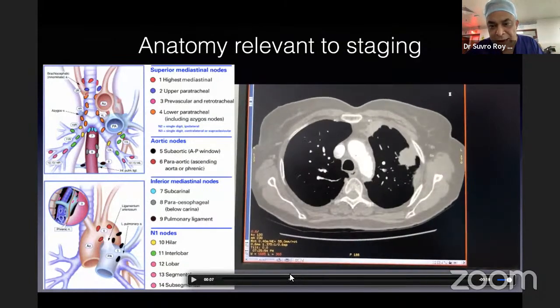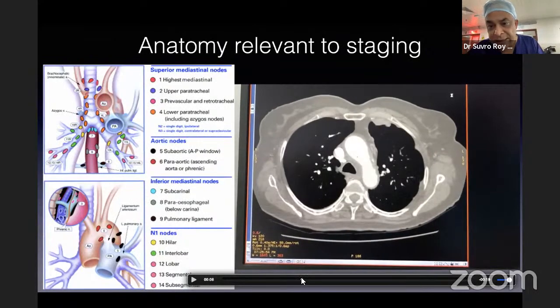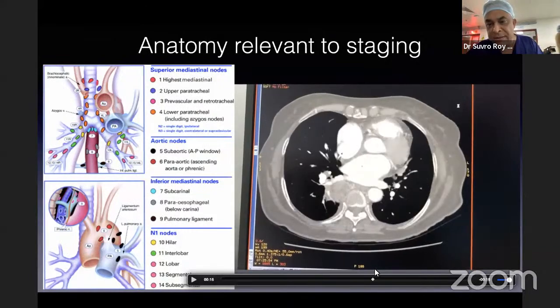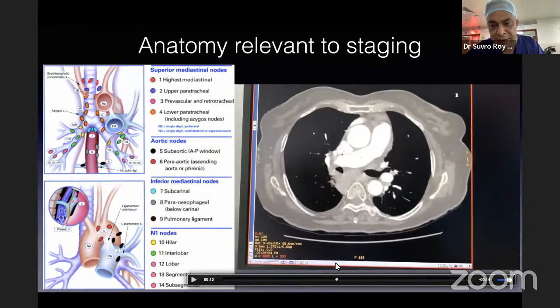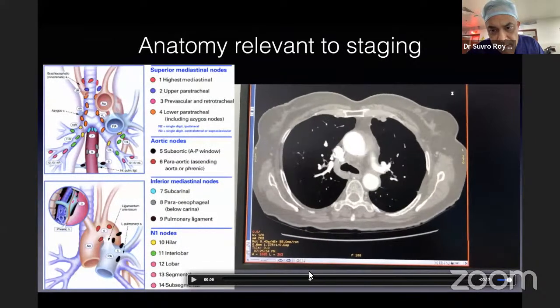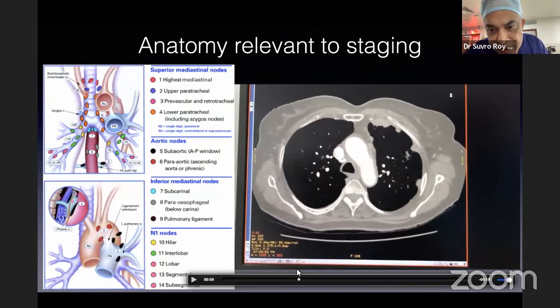But now we also have a lot of pleural-based lesions on the other side, which, if it is a lung cancer, are potentially multiple contralateral pleural-based metastases. Then we can talk about the lymph nodes. So clearly we have got some superior hilar lymph nodes. Again, the windowing is not right.